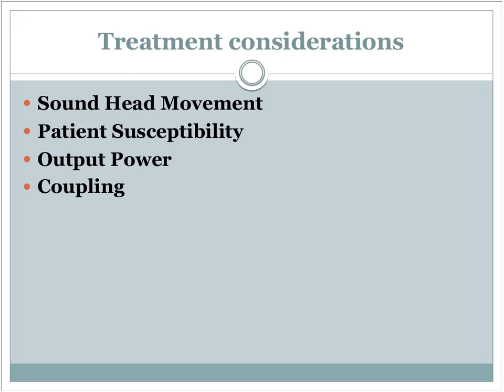Let them know this is going to feel cold. And if they complain and ask why you can't heat it up, now you can tell them, because otherwise the ultrasound is not going to work as effectively.